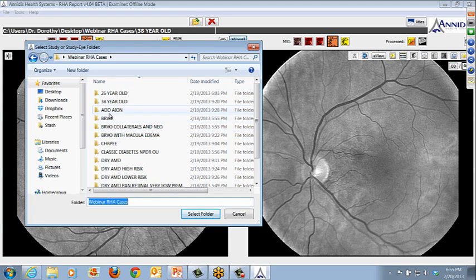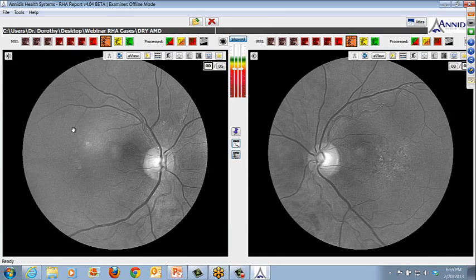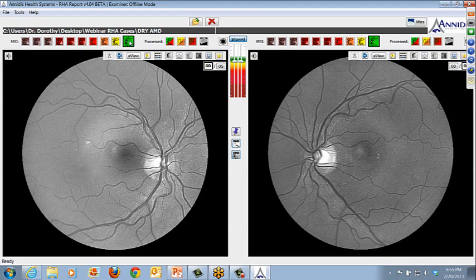All right. So I'm primarily going to talk about AMD, but because I've had so many questions about particular pathologies, I am going to go through some others. I'm going to concentrate on AMD for right now and just walk through some images that are not necessarily perfect and that may have subtle pathology and more overt pathology. So I'll actually start anterior and go posterior in the retina.